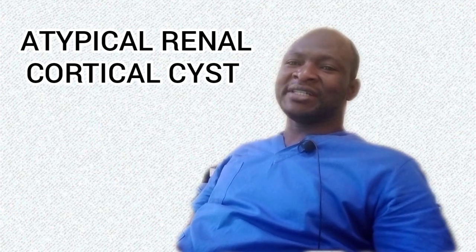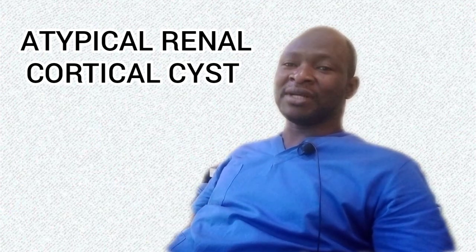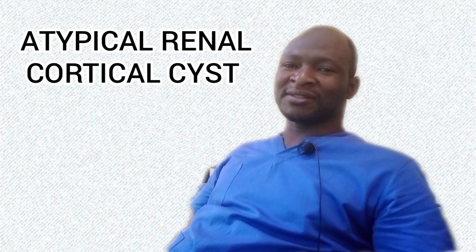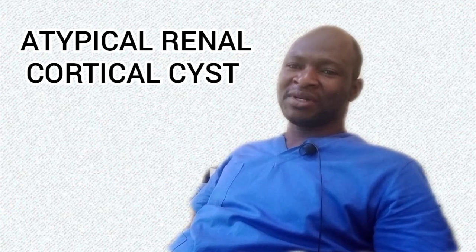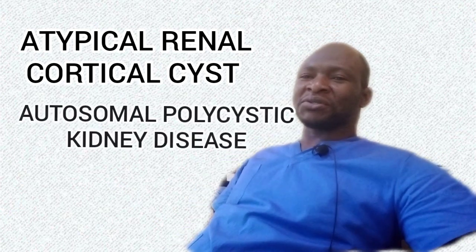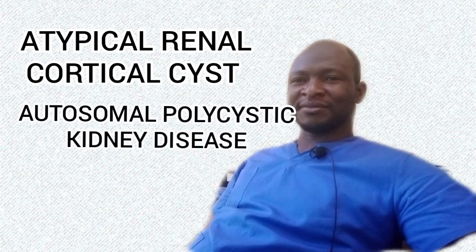Right. Differential diagnosis, besides hemorrhagic or infective cyst or abscess, for a thick-wall cyst lesion may be cystic renal tumor, and may require further investigation. Let's take a quick look at polycystic kidney disease.